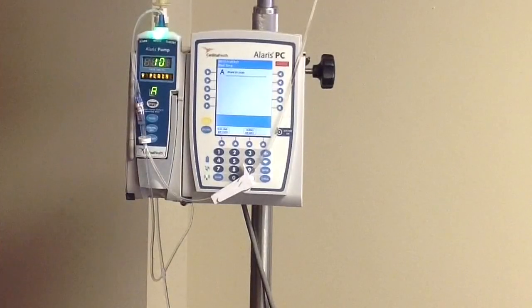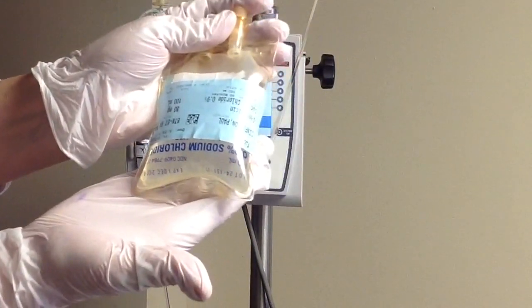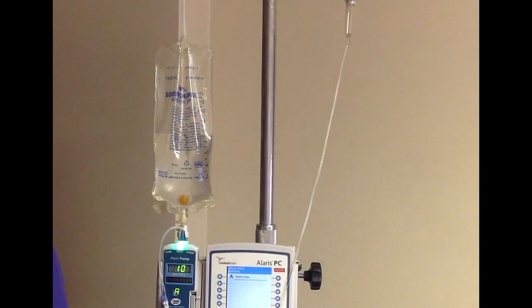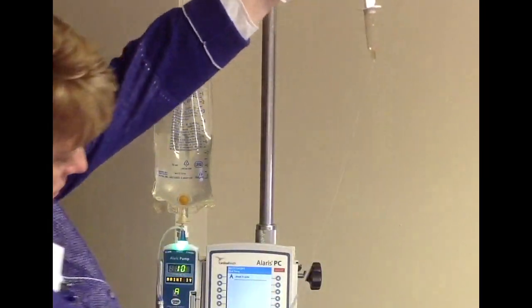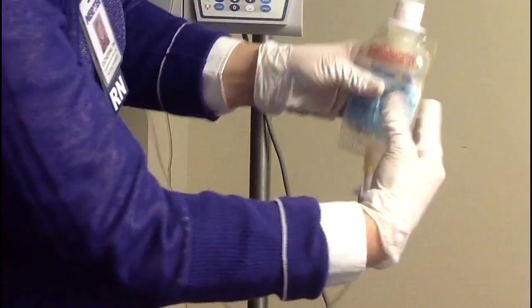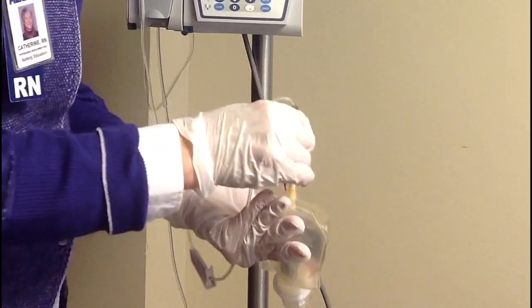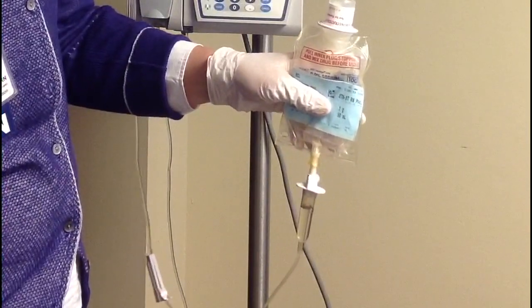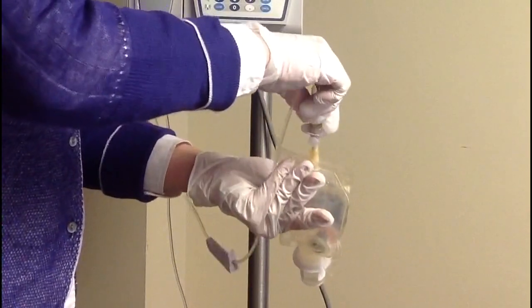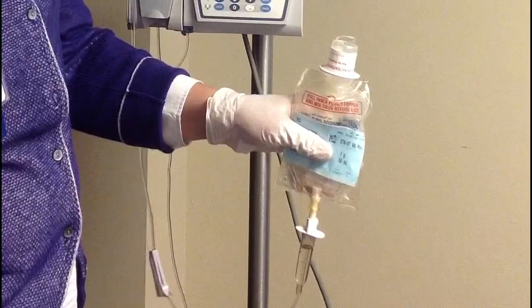Now that a couple hours have passed, we're ready to hang our next antibiotic. We've got our gentamicin there, 80 milligrams and 100 mils, and we're going to back flush our tubing that has a little bit of that cefazolin still in it, just so we can make sure that there's no issues with compatibility. We're going to back flush by dropping our tubing and allowing the chamber to fill. Once that chamber is full, we're going to invert and empty it. We're going to repeat that a total of 3 times. I'm just going to do it 2 more times here. And once we've got that back flushed, we won't have to worry about any issues of compatibility.